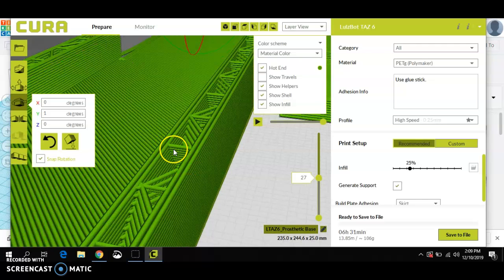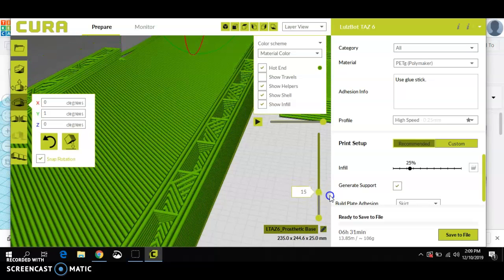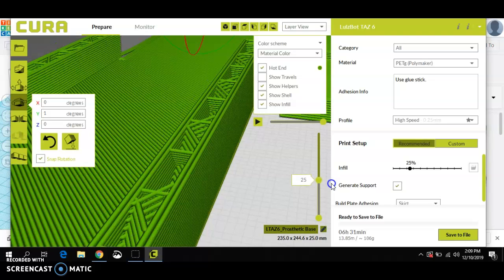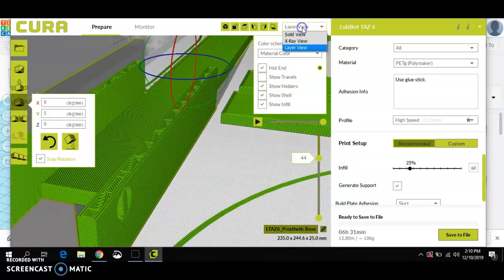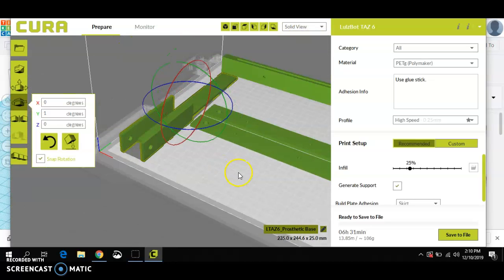Infill actually refers to how much of this is hollow. You almost never print a 3D print solid because it warps. It's too much hot material, and it's not necessary for strength. So there, everything looks good in layer view. You see the difference. Solid view just makes it look more like a solid object.